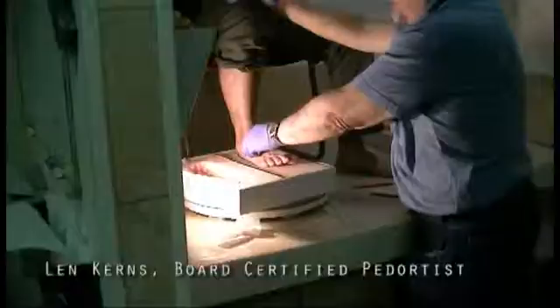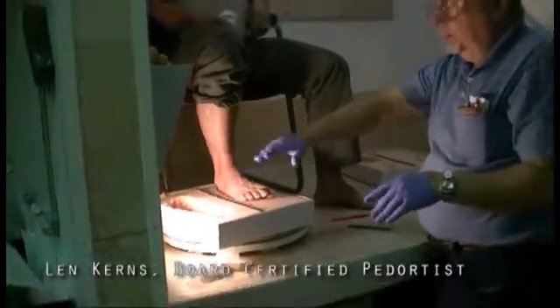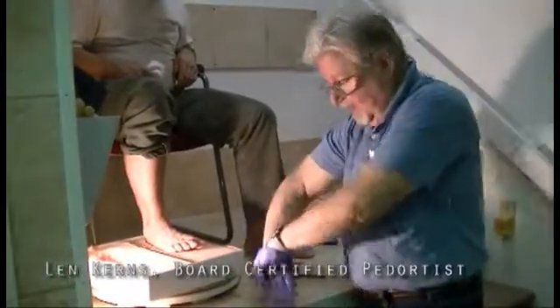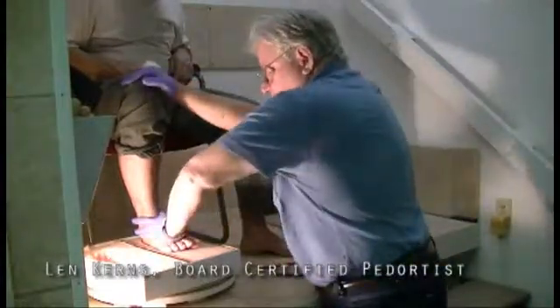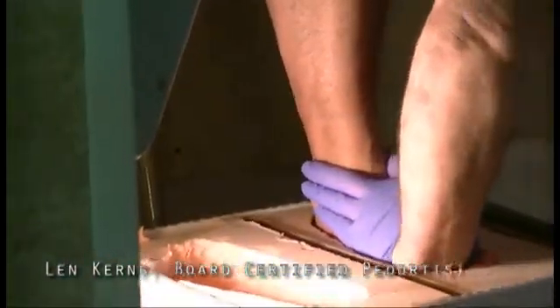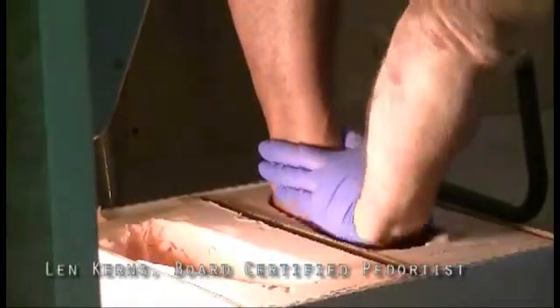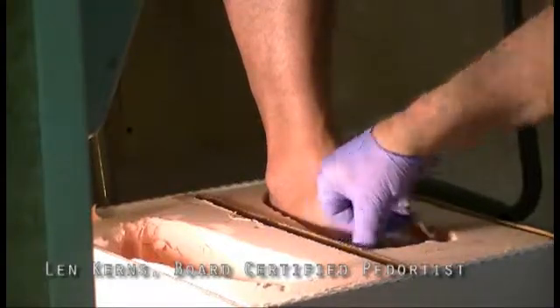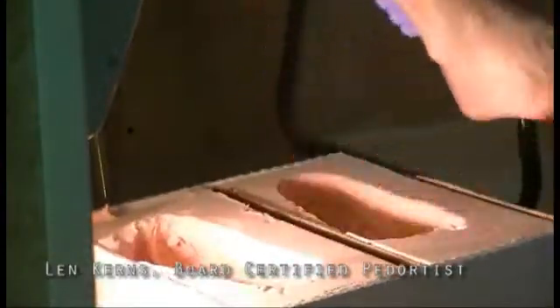And again, you have a little youngster, 4 or 5 years old, and they're wiggling around their foot. Lock them in neutral. Lock your fingers right around their foot and push it down. They can't wiggle on you. And I'll sand the fingers off. Now we're going to take the palm of my hand over the heads again, and I'm just going to go straight down until I feel the fifth hit the bottom. Push the piggies down. Come back over to cuboid and seat it, and then lift the foot up.